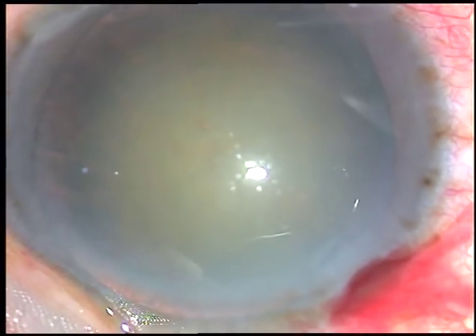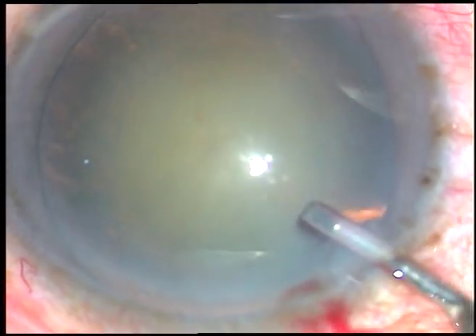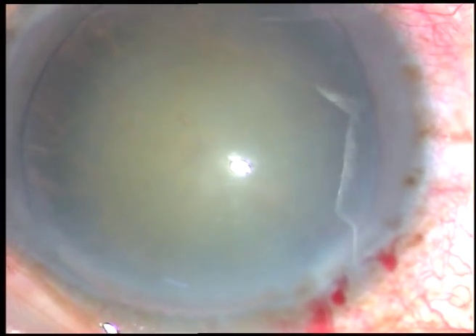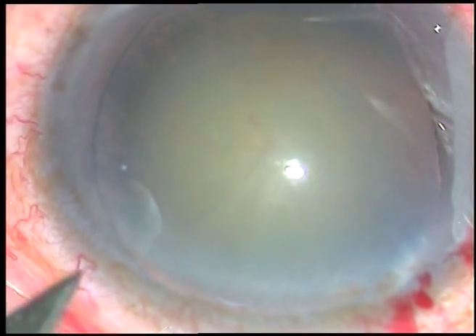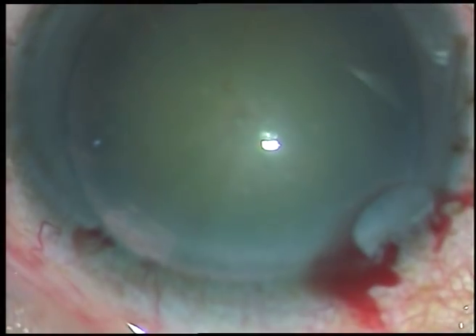By this time the main incision has been placed. Viscoelastic substance is injected into the anterior chamber. And now I'm going to make a stab incision on the left side of the main incision, about two and a half clock hours away.